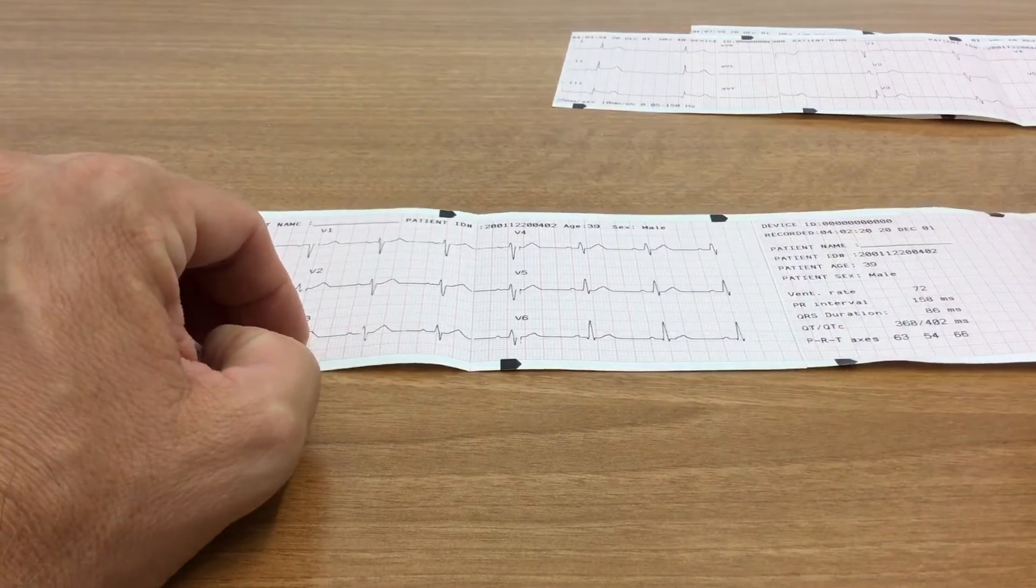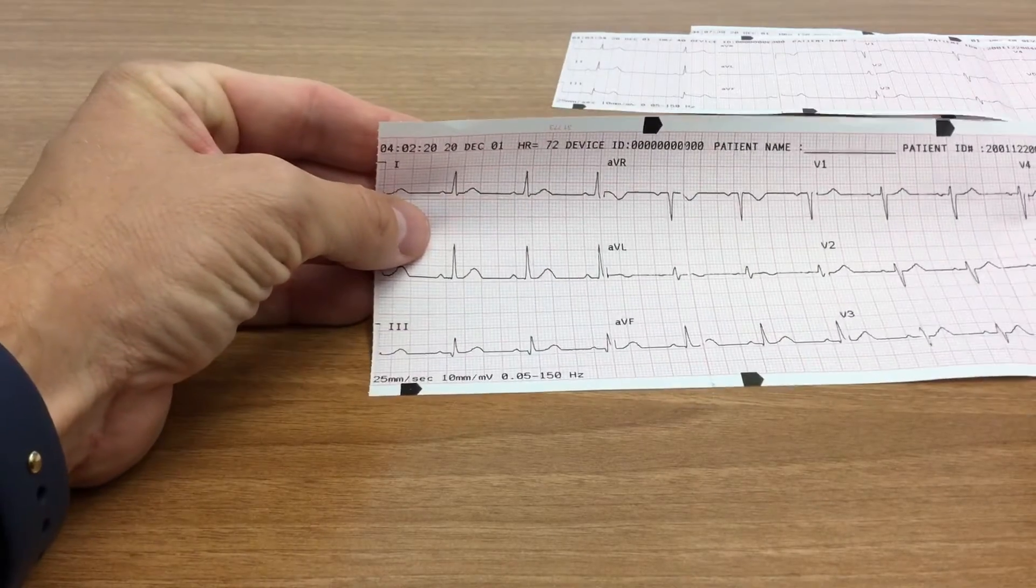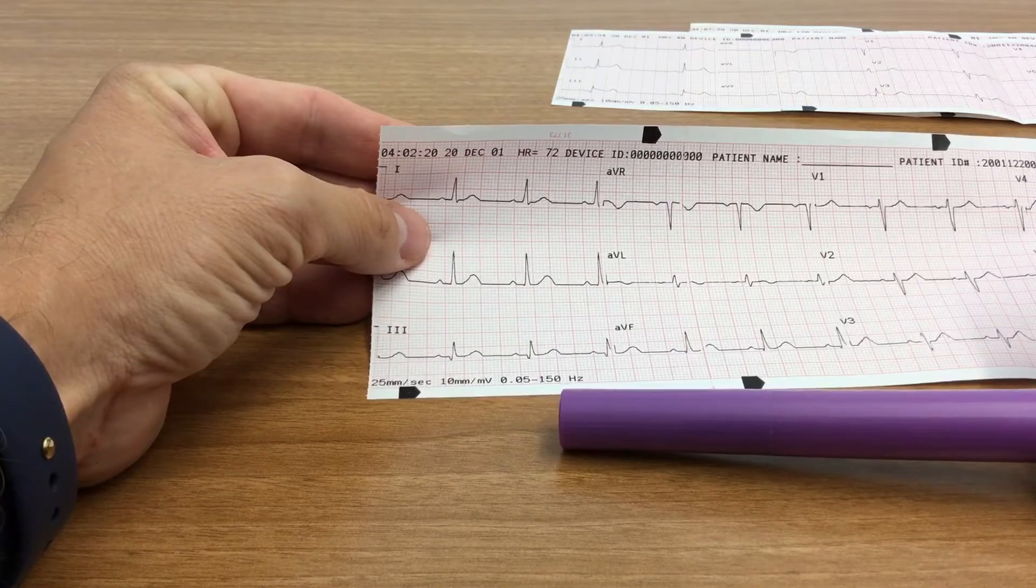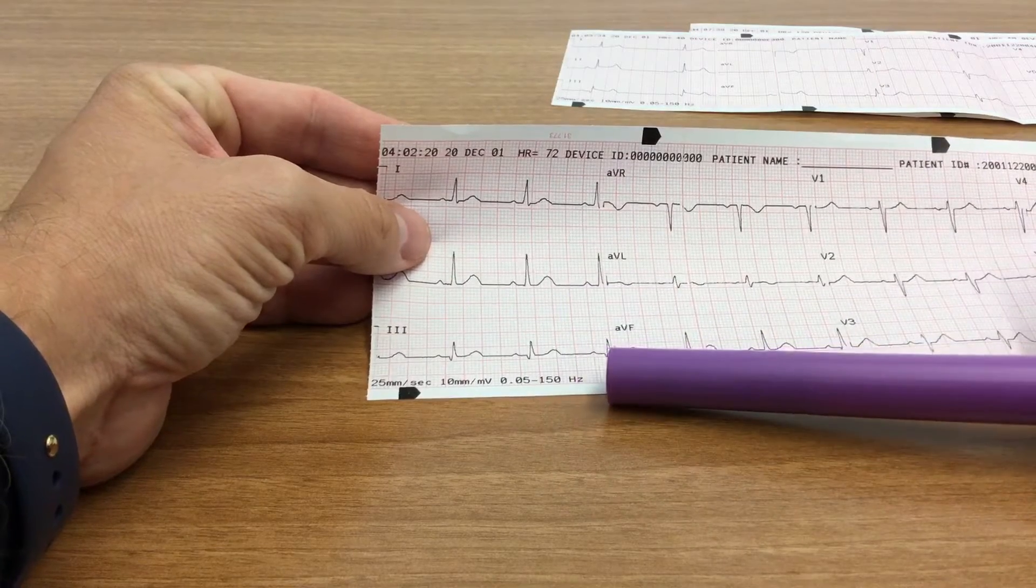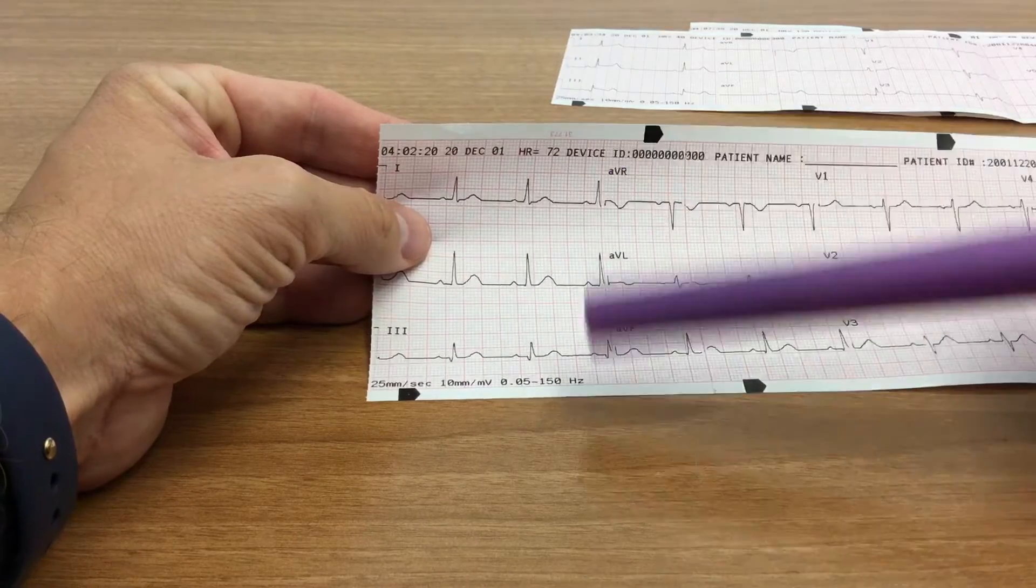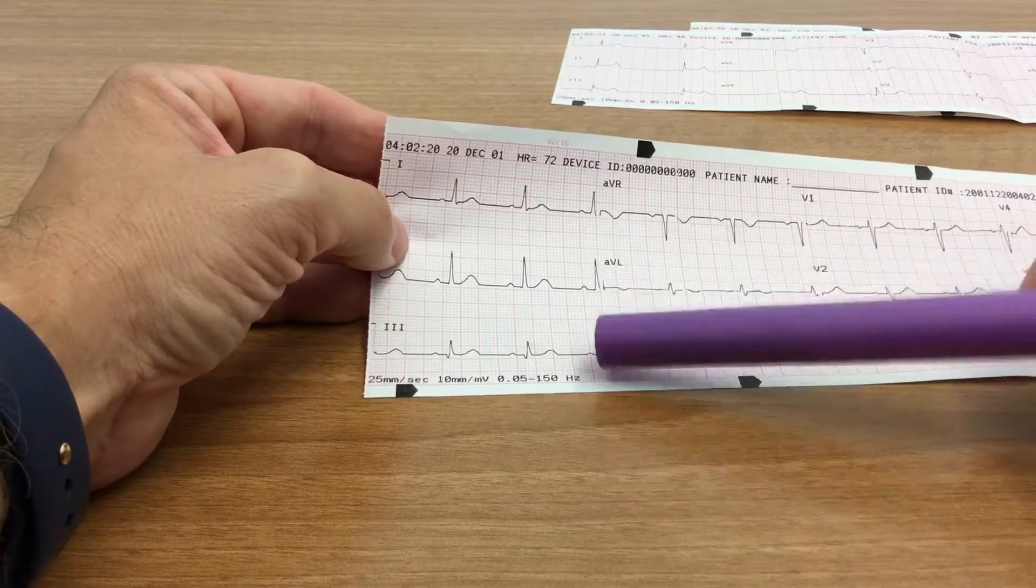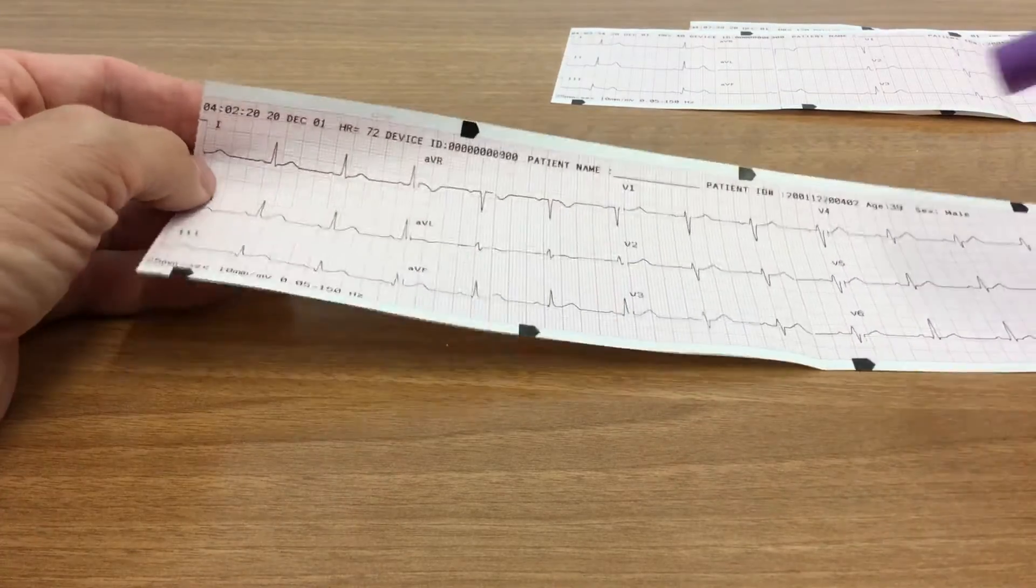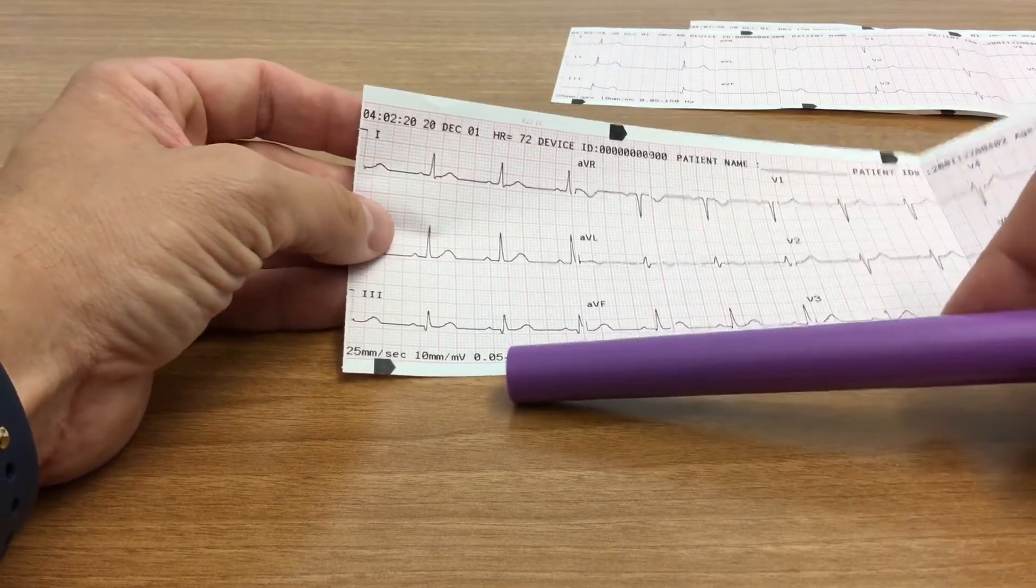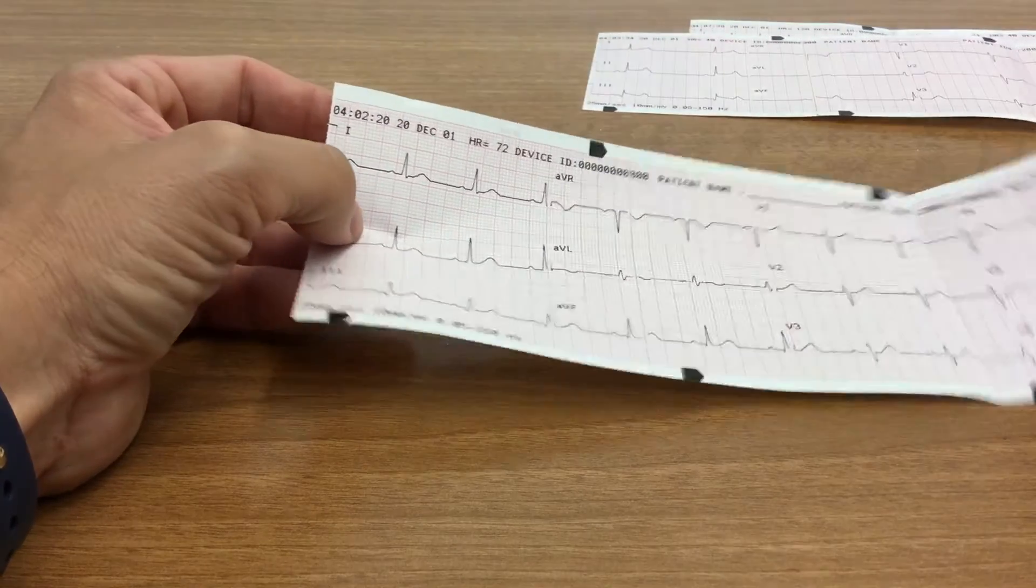And you can see down here that my filter is 0.05 to 150 hertz, which as you guys learned in class, those of my students, that this is a diagnostic quality ECG. Which is actually what you want to see when you run a 12-lead, you want to see that greater range represented instead of like 5 to 50 or 5 to 30 hertz.